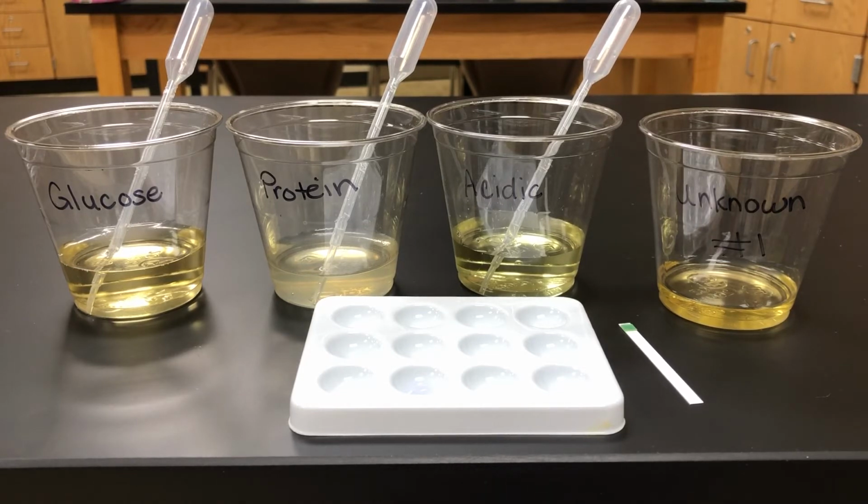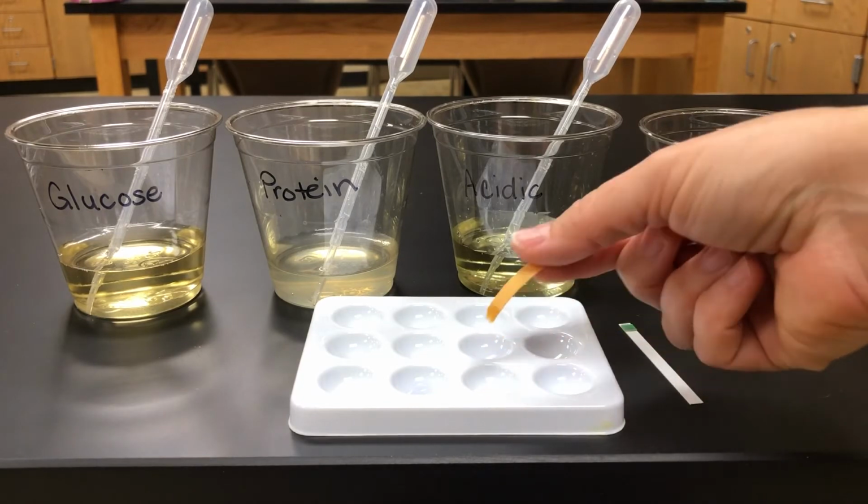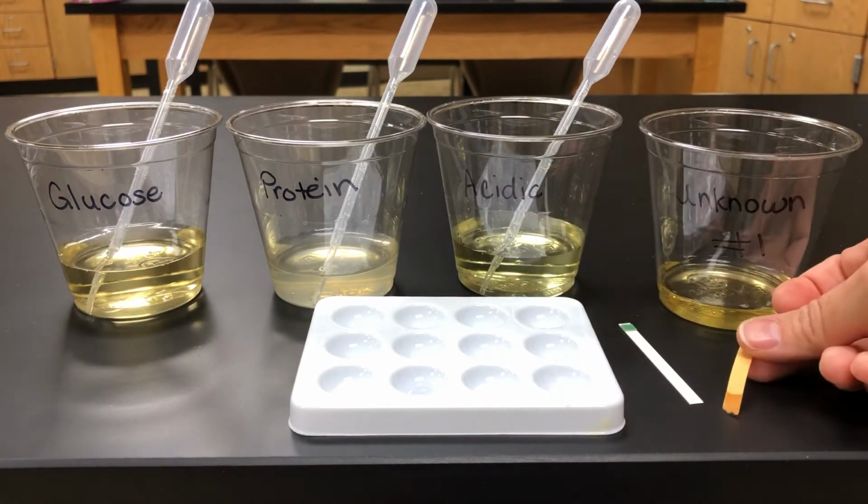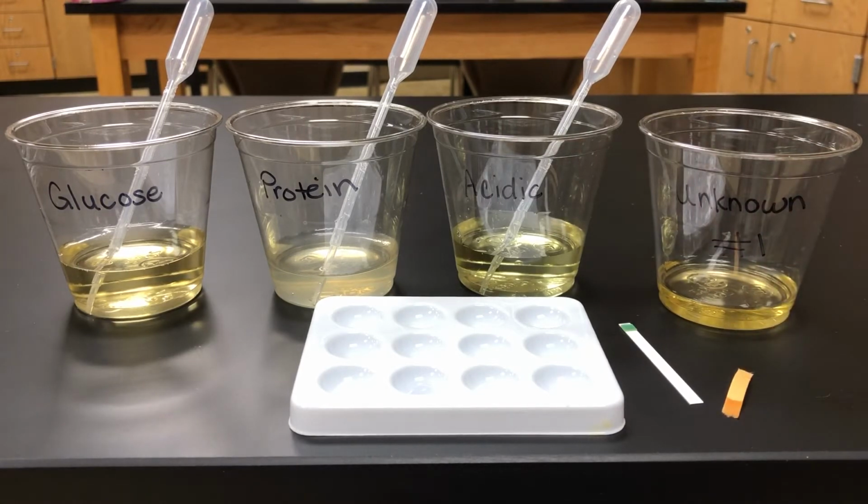For the pH paper, we just want to get a little corner into the solution, and then we'll let it sit. We'll give that a minute or so to sit, and then we'll compare it against the chart.